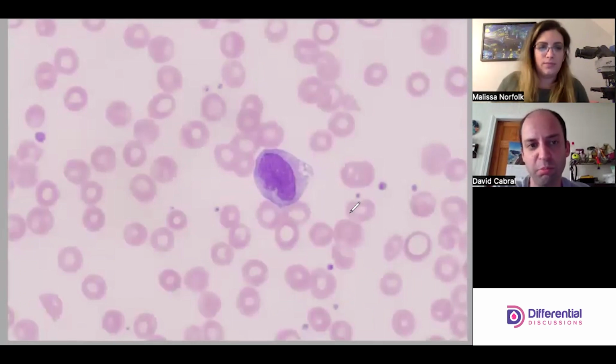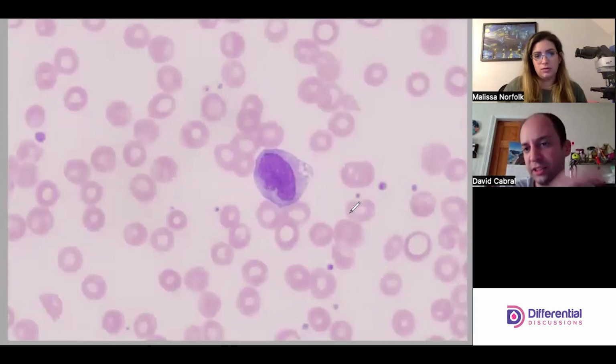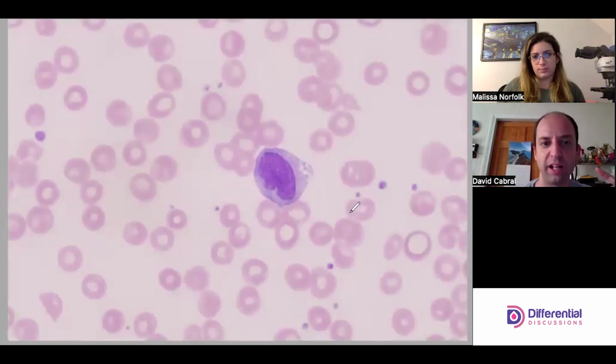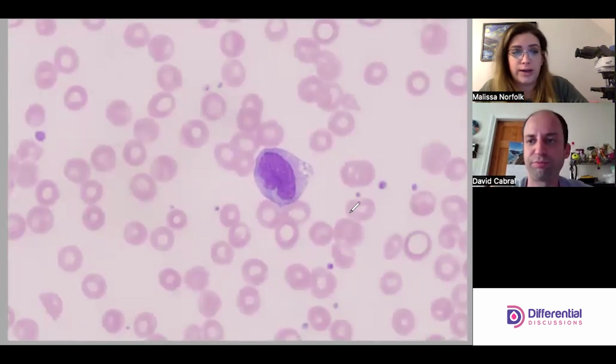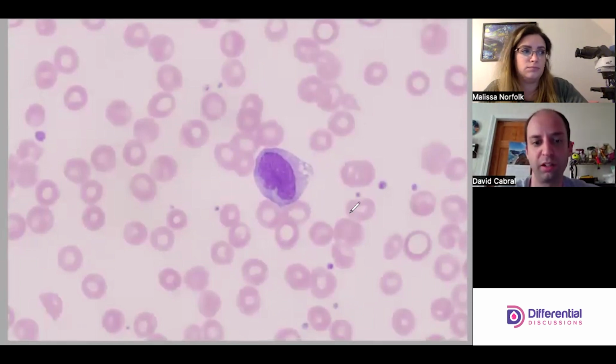Yeah, mono. Other things I'm looking at are platelets and red cells and stuff. I don't see anything too crazy standing out on that side. And platelets have looked pretty adequate. If they're not close, they're pretty darn close. Yeah, it looks pretty good.